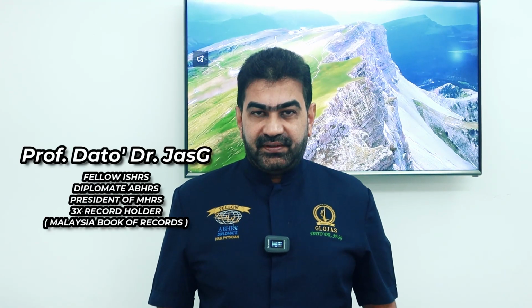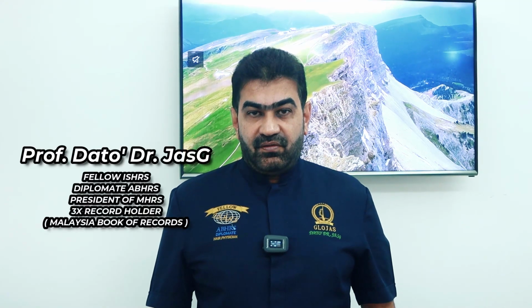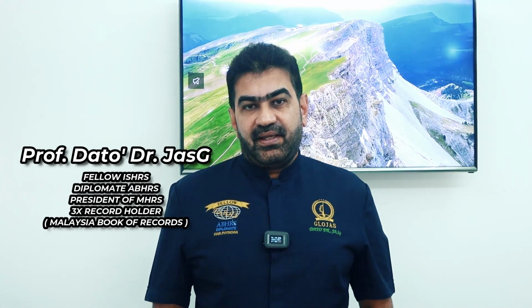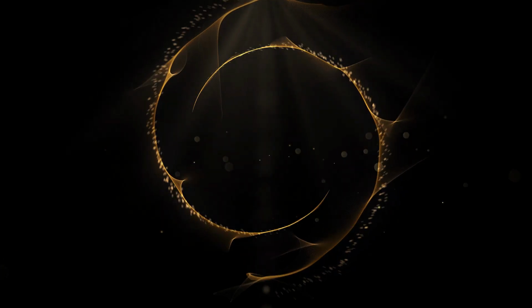She's not happy with the microblading done by the beautician at the site of her hairline, which is not natural and looks like a tattoo. Indication here today is lowering hairline and also to camouflage the tattoo look at the side of the head, and we are using the smart FUE technique.